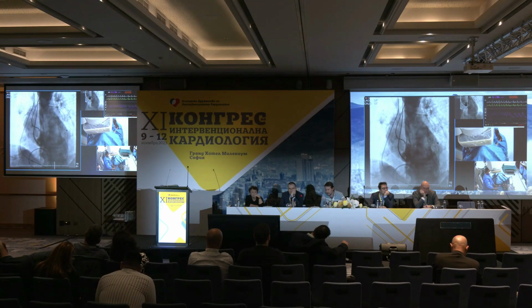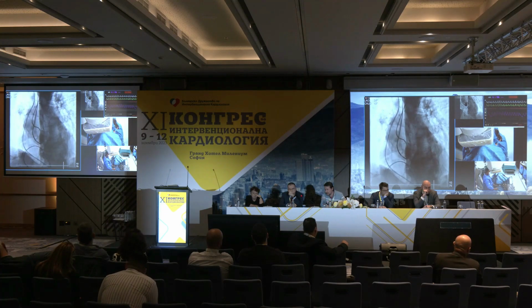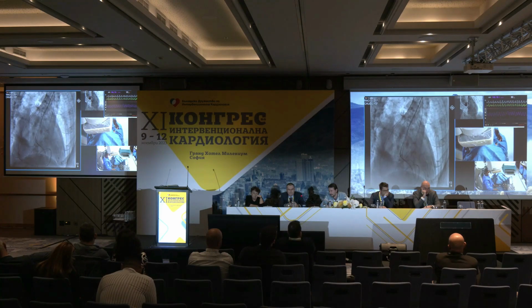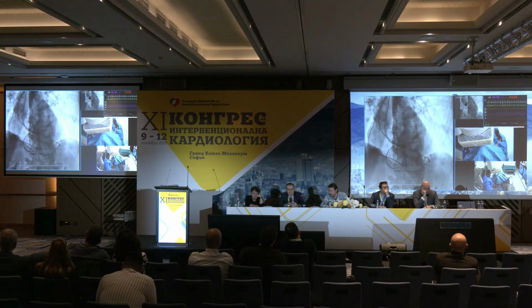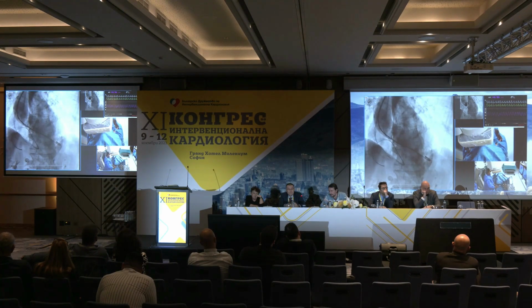You have to have some notion about the strange anatomy, and you see there is a more or less horizontal aorta, and it changes anatomy because the usual projections for cusp overlap and tricusp view were not working. Go next, and we have crossed. Okay, next. Fortunately, the left ventricle is not too small. We had some suspicion that the ventricle is extremely small, but fortunately it's not so extremely small. Next, please.